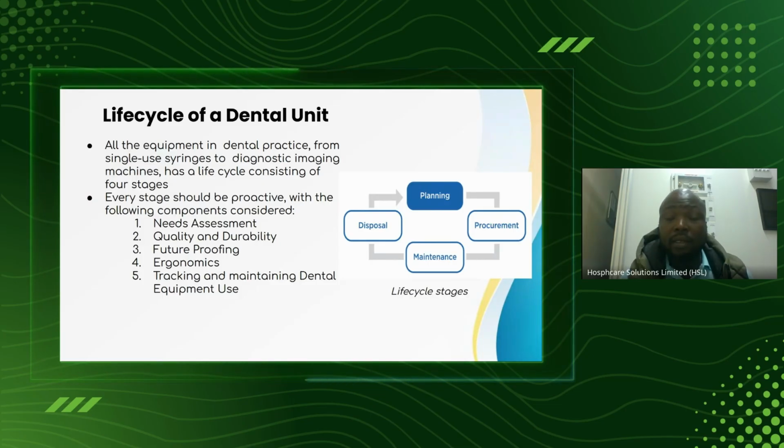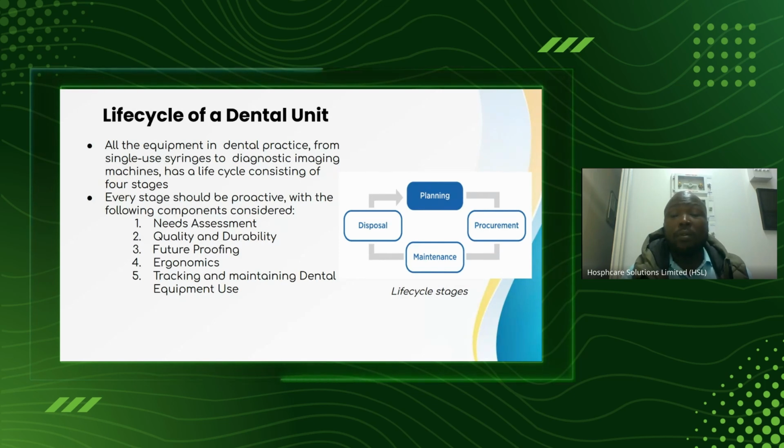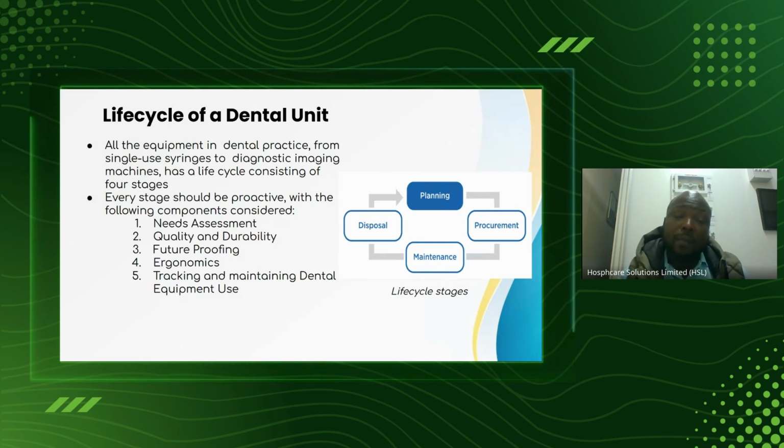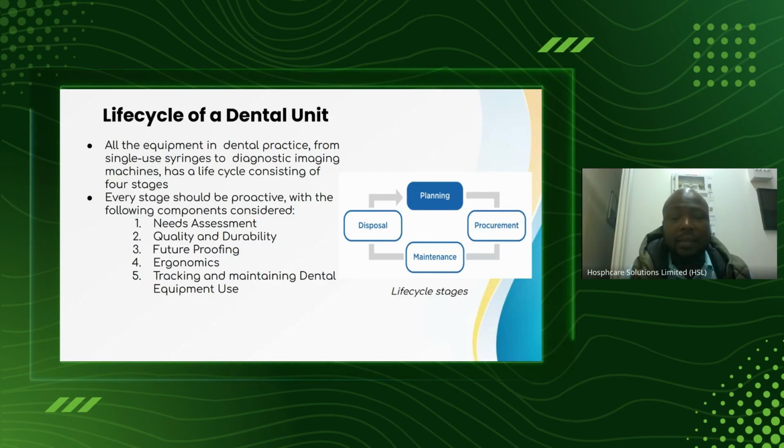So there must be a very effective drainage system with an odor trap mechanism. If you go into detail in plumbing work, you'll be able to know how to design that. Now, from designing, you also need to have a pure or safe power point, a power that doesn't have leakage current, doesn't have a lot of short circuiting, and needs to be stable.